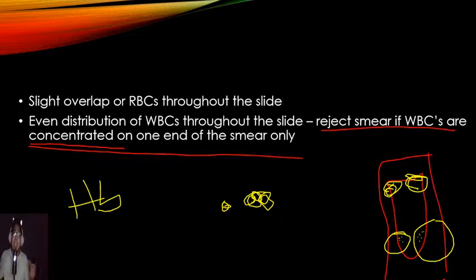Parang ginawa nilang team effort yung paggawa ng smear. Kasi yung isa may hawak na pipette dun sa kabilang gilid, yung isa may hawak na pipette dun sa kabilang gilid. Kasi hindi umaabot, nabibitin kasi siya. So nakita ko yun, okay.